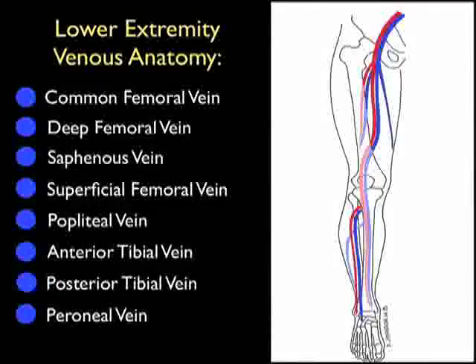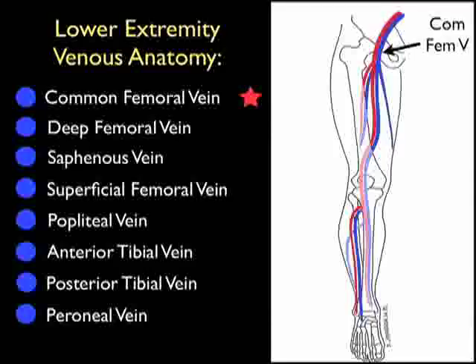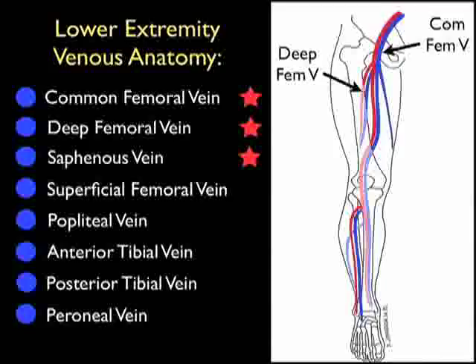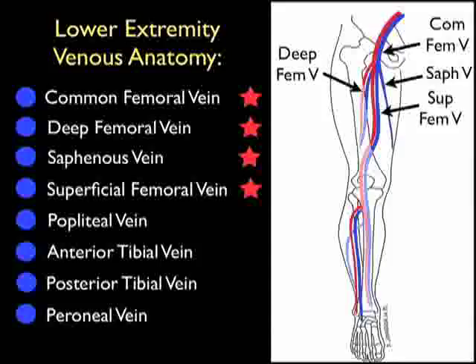Let's now review the lower extremity venous anatomy integral to performance of the focused DVT examination. We begin by identifying the common femoral vein, seen just below the inguinal ligament, just medial to the common femoral artery. The common femoral vein continues down the leg to bifurcate into the deep and superficial femoral veins. We note the deep femoral vein coursing to the back of the leg and the adjacent deep femoral artery. We also see the saphenous vein which joins into the common femoral vein above the level of bifurcation. The superficial femoral vein is the vein that continues down the leg to become the popliteal vein behind the knee, accompanied by the paired superficial femoral artery.